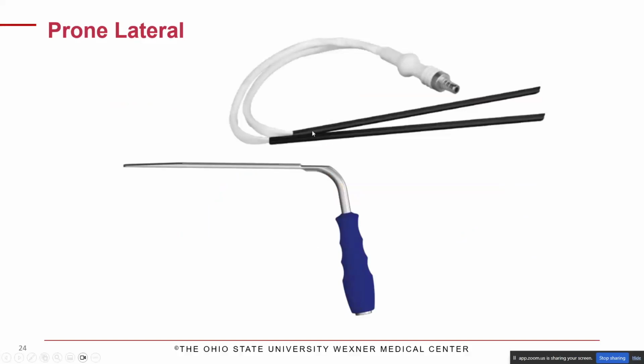I think multiple vendors have something like this, but you have a long handheld retractor and then a light that inserts into the retractor and lets you see very well. In patients with large body habitus, I might actually use two and have one of the assistants pull. I'll have the assistant pull posteriorly, while I pull anteriorly, or vice versa.